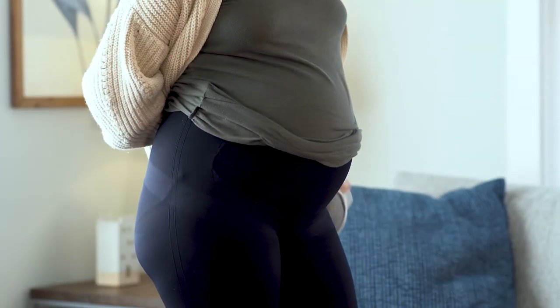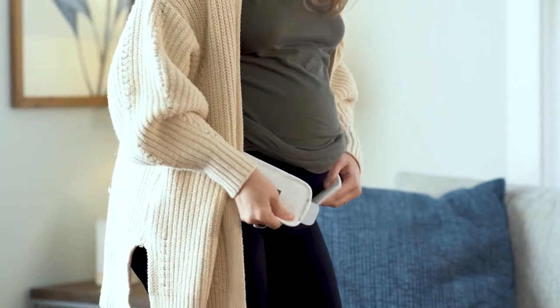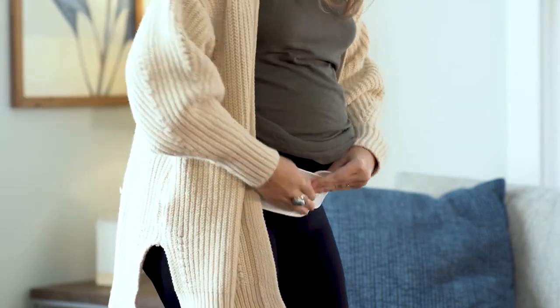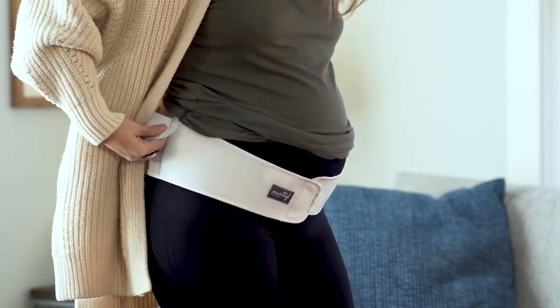How to wear the Motif Pregnancy Support Band: First, make sure the straps are positioned in the back and the Velcro is attached in the front. Secure the front of the band like a cradle, typically below your belly button.